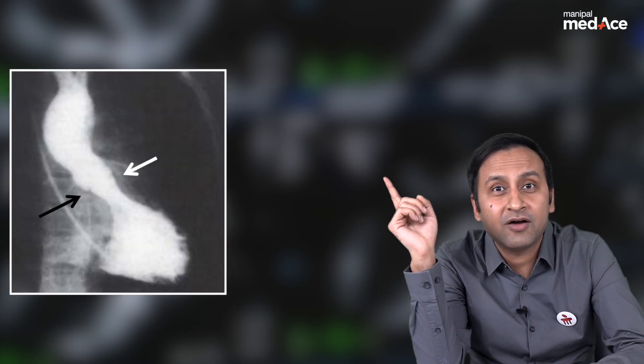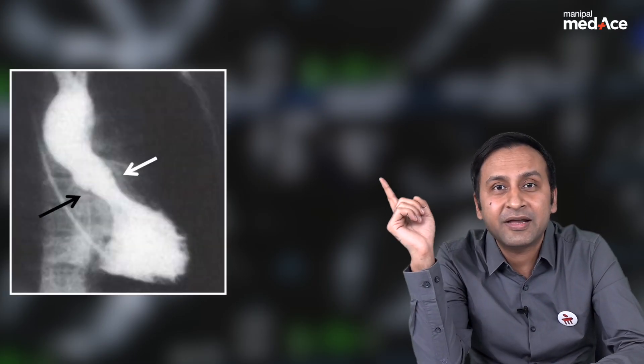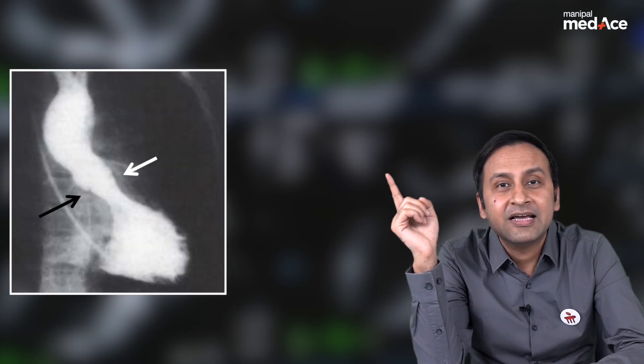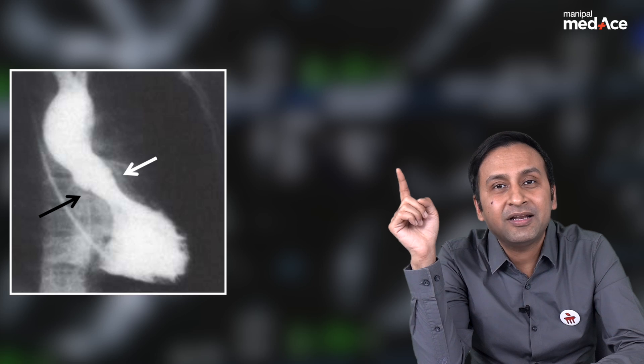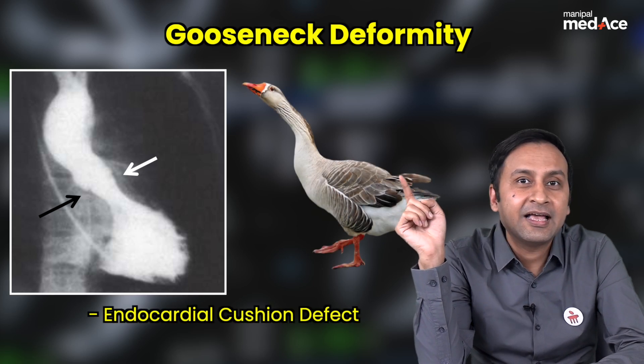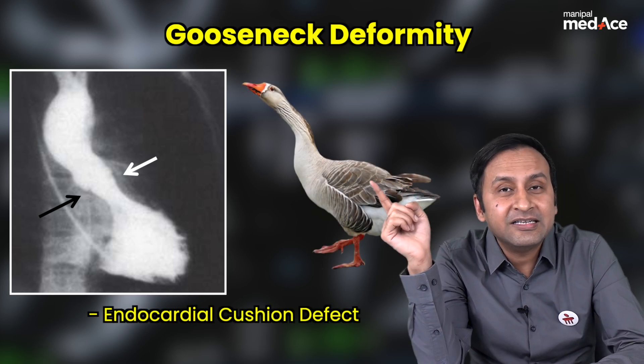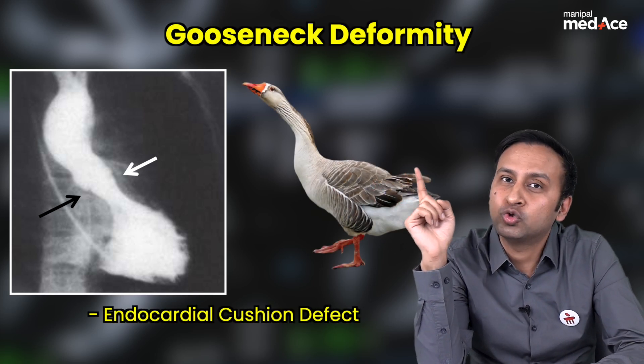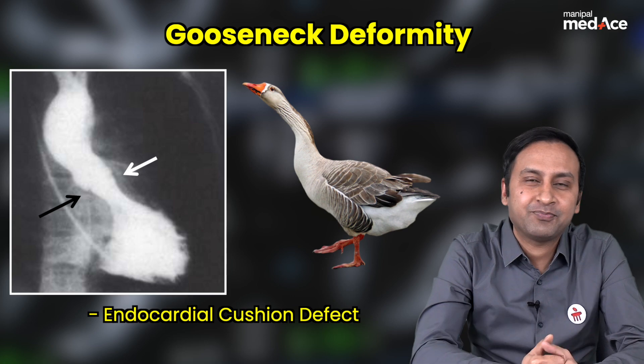Let us have a look at this radiograph. What is this appearance looking like? This appearance is typically looking like a goose neck, and this is typically seen in patients with endocardial cushion defects.